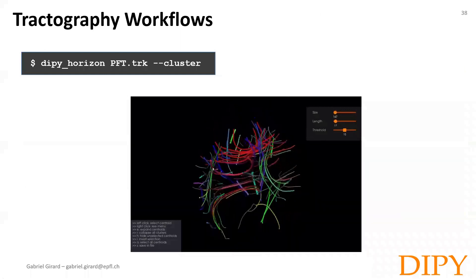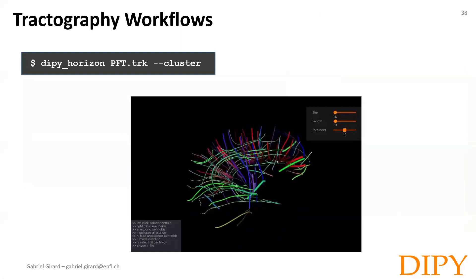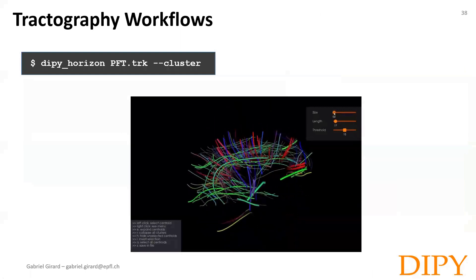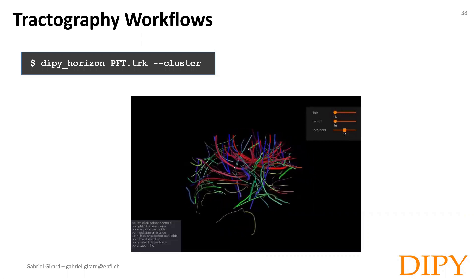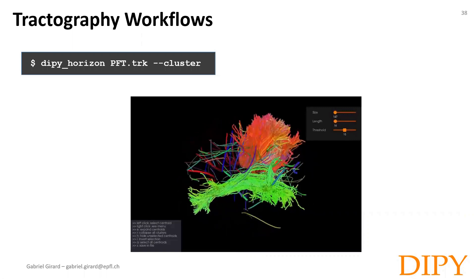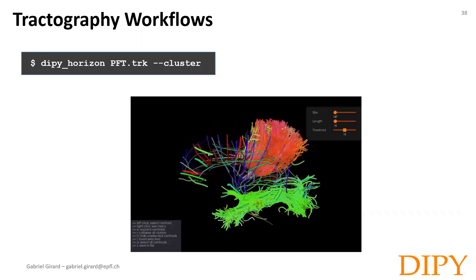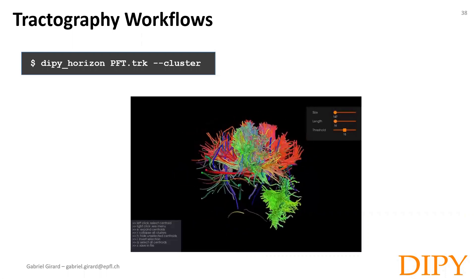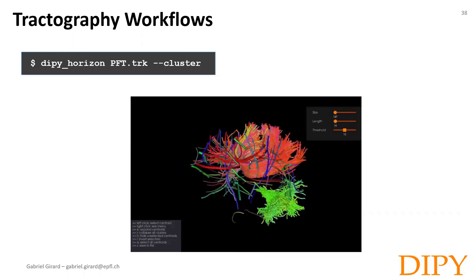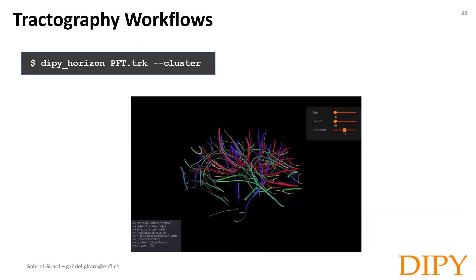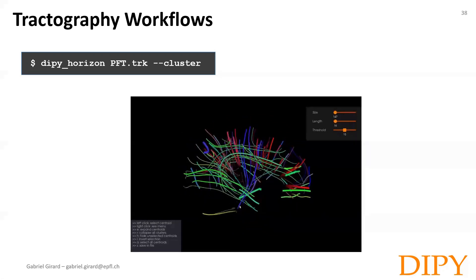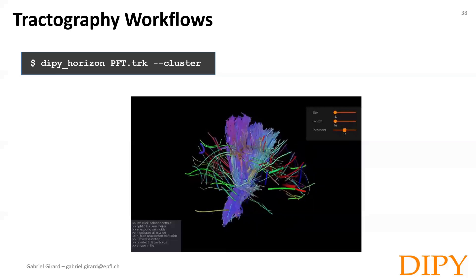Again, we can visualize the resulting tractogram. The tubes are the centroids of bundles of streamlines — the larger they are, the more streamlines are in the bundle. We can filter the centroids visible by length or by size. You can also expand clusters to see all the generated streamlines. In red, the part of the corpus callosum. In green, the inferior fronto-occipital fasciculus. And here in blue, the corticospinal tract.